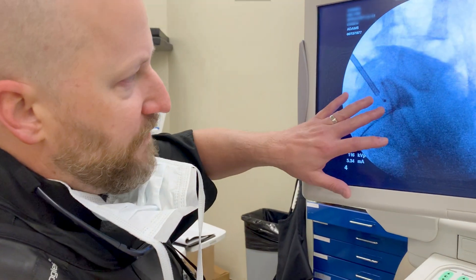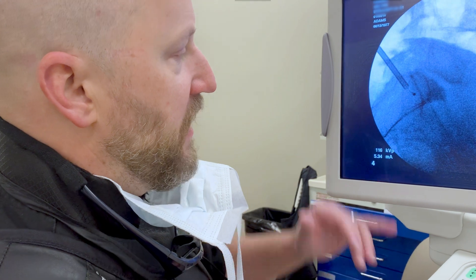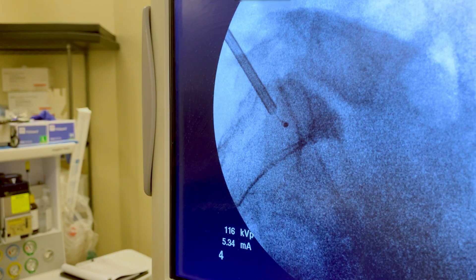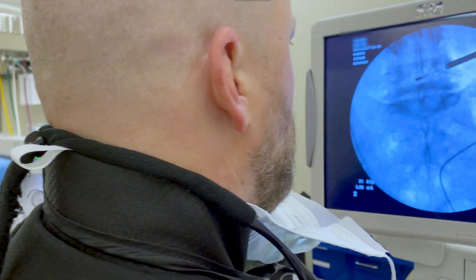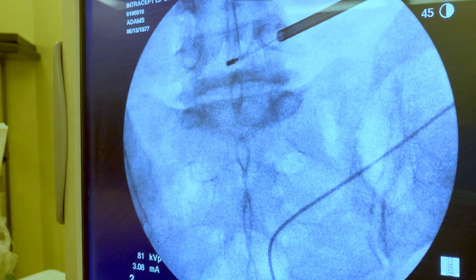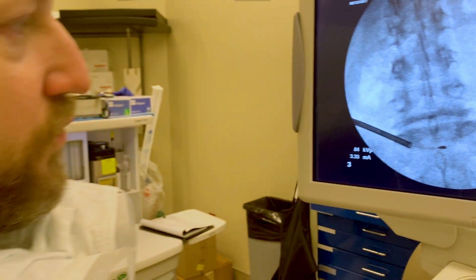Again, we're looking at the S1 vertebral body here. The anatomy of the S1 vertebral body is slightly different, so the target is a little lower than what we might see with the other vertebral bodies. But again, we see the bipolar probe here within the body of the vertebral segment at S1, appropriately addressing the basivertebral nerve. The goal from a front-to-back standpoint is to get right across the midline, which we see here at the spinous process line. These are the two poles of the bipolar tip, and again we see that down here at S1 crossing the midline. So good placement of the bipolar probe, and hopefully the patient is going to get adequate and sustainable relief from this.